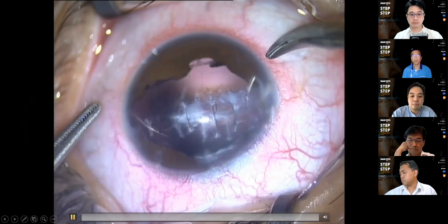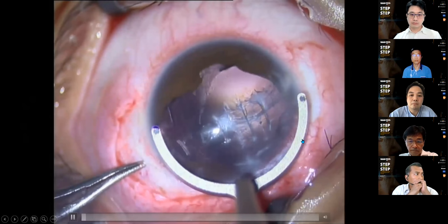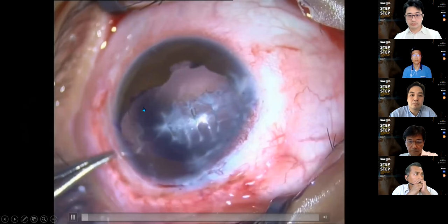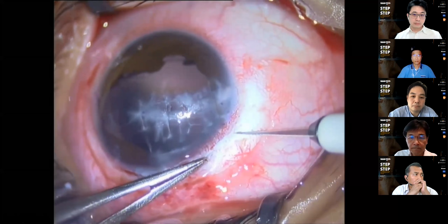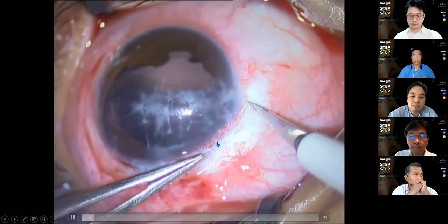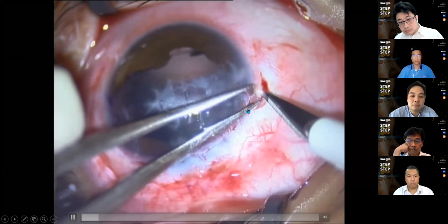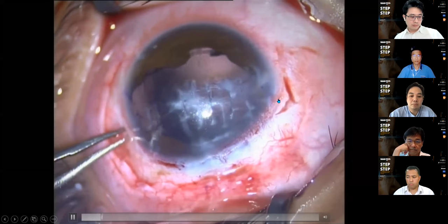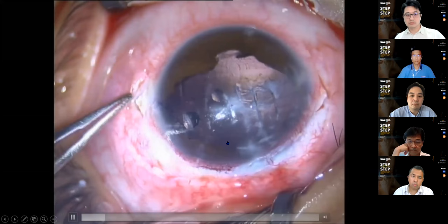So let's see. My peritomy has to be almost three-quarters, to include the formation of the scleral flap. Then I mark the cornea at 180 degrees with the line passing through the center of the cornea. Then I create the flap to hide the knot for the IOL eyelet. I mean the suture of the IOL eyelet. The flap you can make triangular or rectangular, it doesn't matter, but you have to make quite a big base so that it's easier to handle, about half thickness of the sclera. You don't have to make it until it reaches the limbus because we are not doing a trabeculectomy, but the apex of the flap is at least about 3 millimeter because your entry point of the needle will be at 2 millimeter.